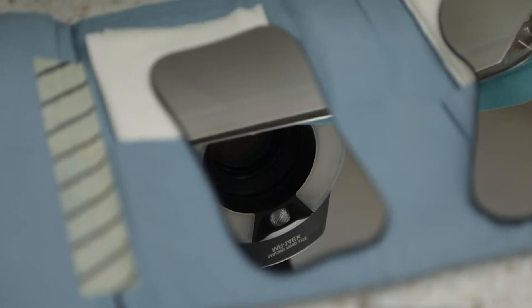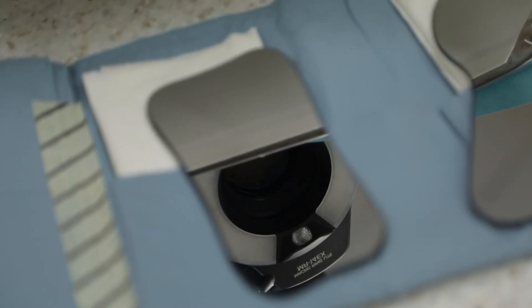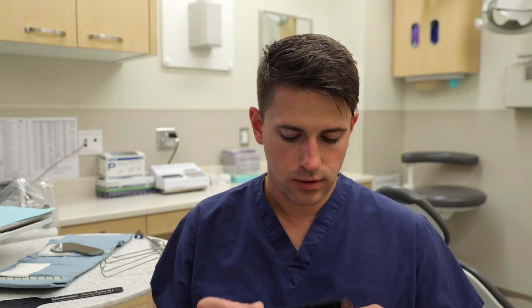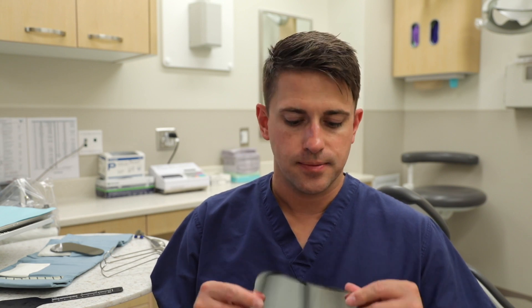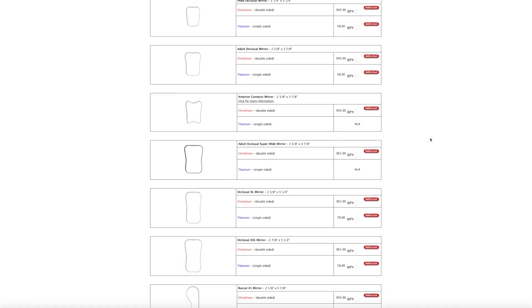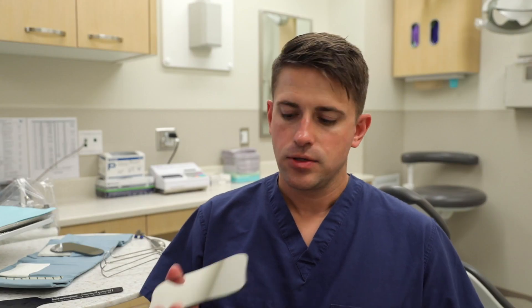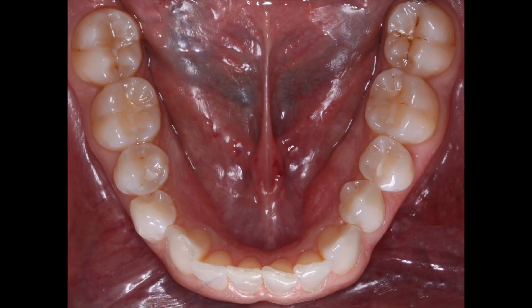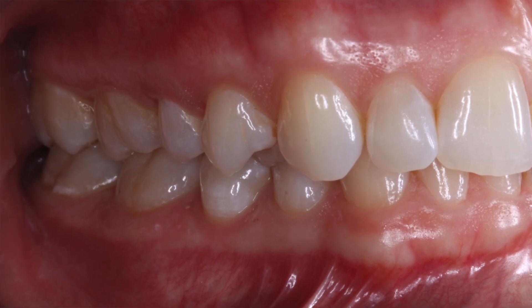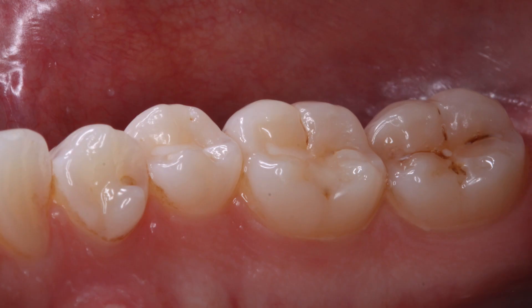Some other things you may want to get if you're going to do clinical photography would be some mirrors. I have a variety of mirrors here — I'll show you a couple I commonly use. This mirror here is an occlusal mirror, mirrored on both sides. Mirrors like this come in different sizes: small, medium, large, and pedo size. A standard size mirror is going to be adequate for the majority of your patients. You can also use mirrors like this for buccal or lingual views of a specific quadrant.